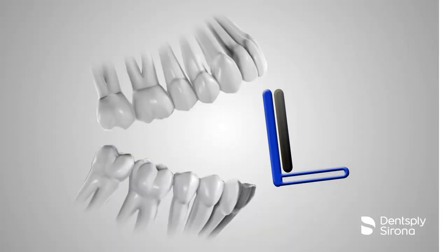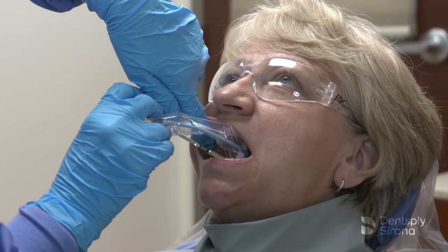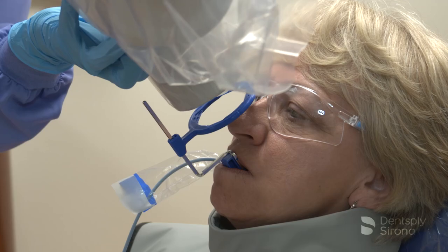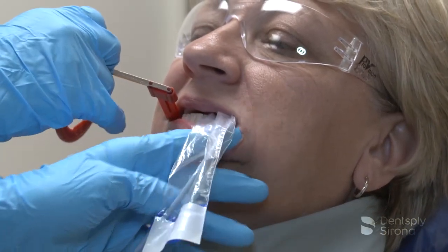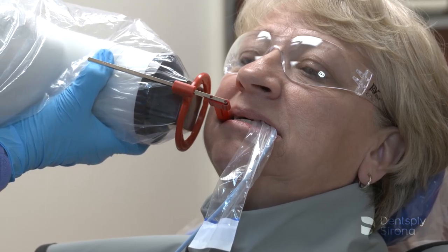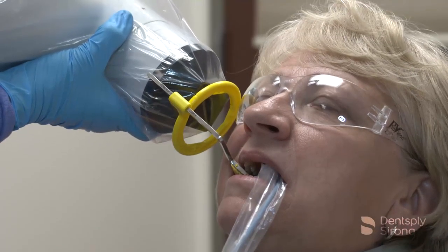The paralleling technique is used for both periapical and bitewing radiographs and is the most accurate technique for taking these projections. Receptor instruments with x-ray beam ring guides improve the accuracy of the PID alignment to ensure correct beam angulation and centering. Receptor instruments combine a receptor holder with an arm that has an attached ring indicating the position for the PID. This helps the operator avoid cone cut errors by specifically directing the x-ray beam toward the center of the receptor.